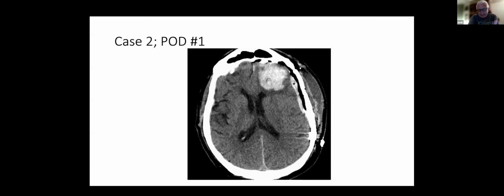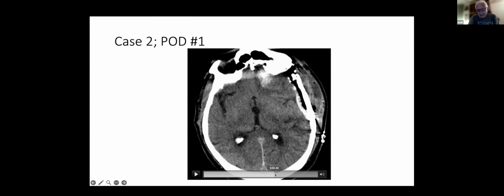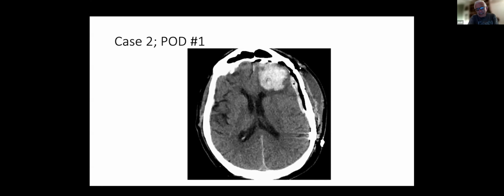At least looking at this, can you go a little bit further down to see where it comes from? It doesn't really. Yeah. So if it were the fistula, the remnant of the fistula, you would expect it to be really close to the bone, no? Because that's where it was. So the point is, maybe it's a different problem.